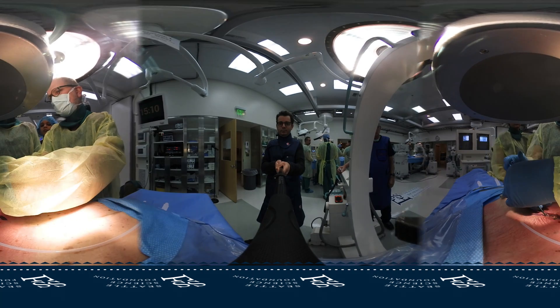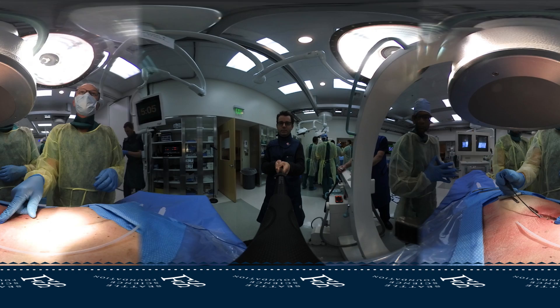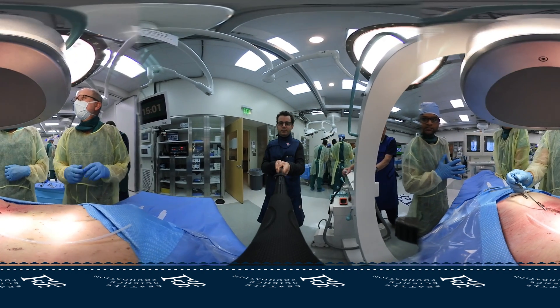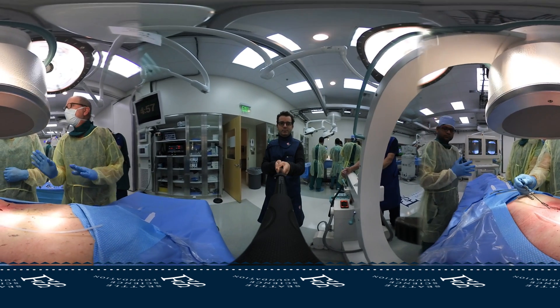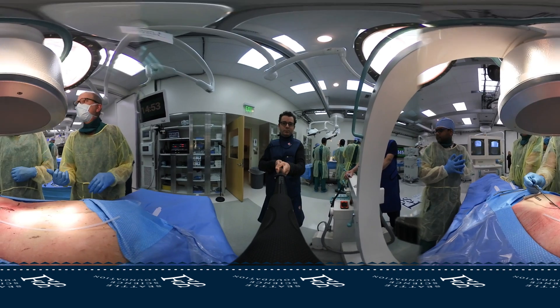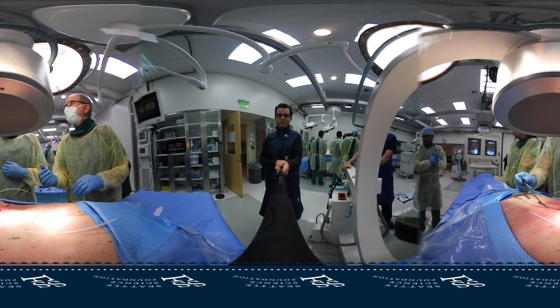You can kind of use this to guide and find those. Hold down here. Come up higher so we see more towards the needle tip. And picture. So you just want to come towards us a little bit. That's good.